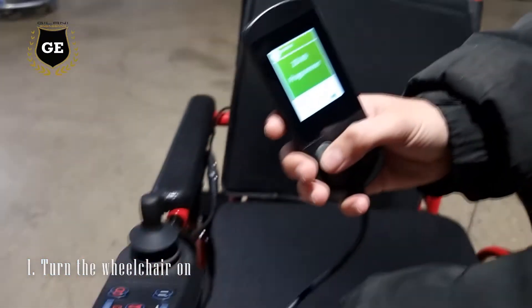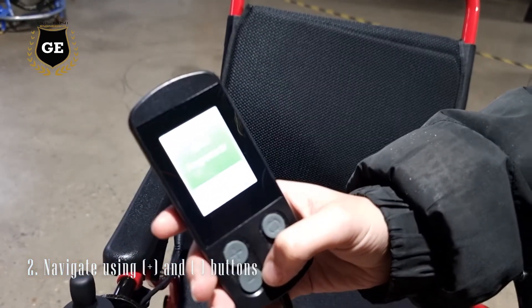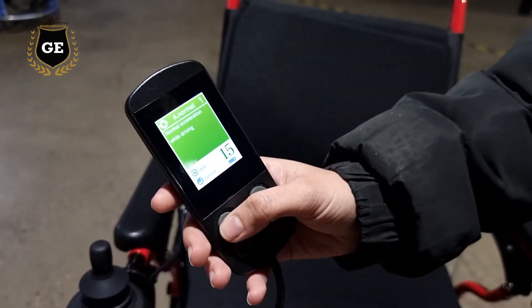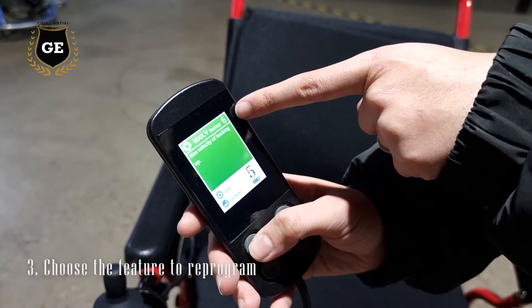Just turn it on like this, and use the plus button and minus button to navigate the features that you want to change. That's number one — there are 21 different features that you can choose to reprogram.